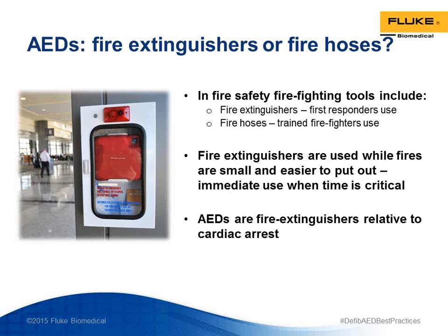However, the AED's effectiveness is determined by much more than simply just having the device around. A complete program that includes risk assessment, training, maintenance, and record keeping must be in place, much like defibrillators. To enable AEDs to be used by just anyone, AEDs contain very sophisticated computer assessments of the patient's ECG and determine shockable versus non-shockable ECG wave patterns. AEDs are battery powered, so they really can be completely portable and brought to the victim wherever he or she may be. The AED batteries are crucial to the delivery of the right amount of current flow to convert cardiac arrest into normal sinus ECG.